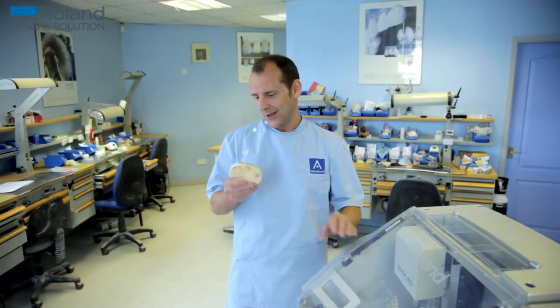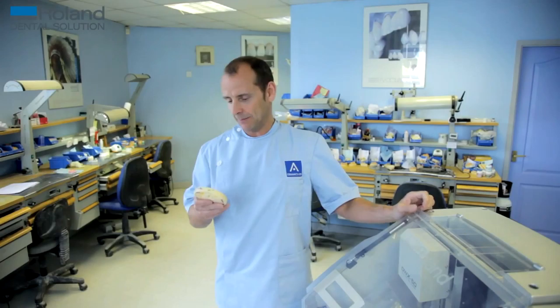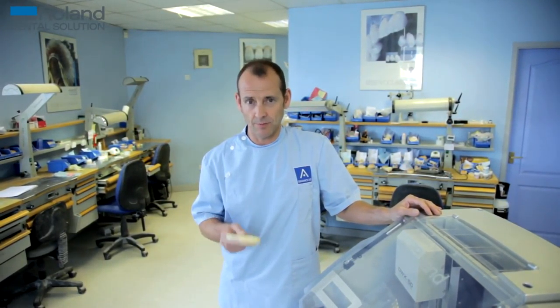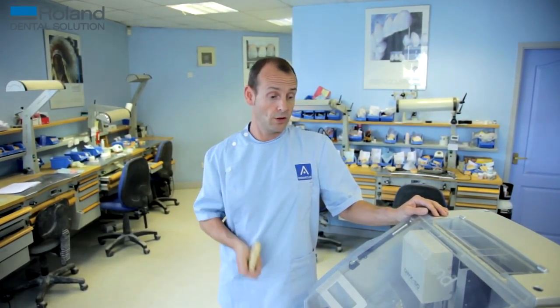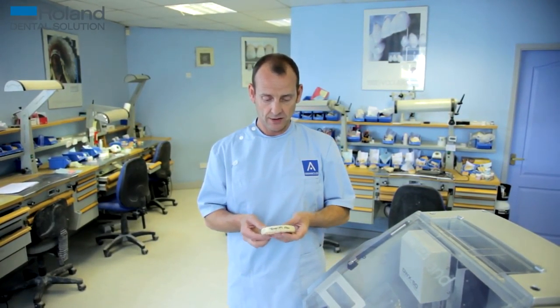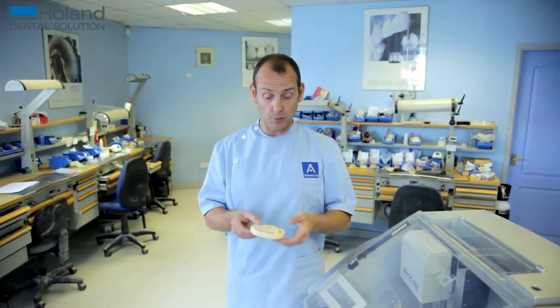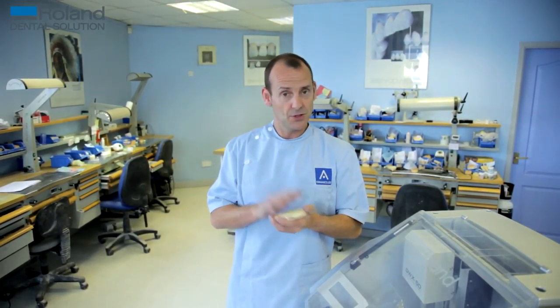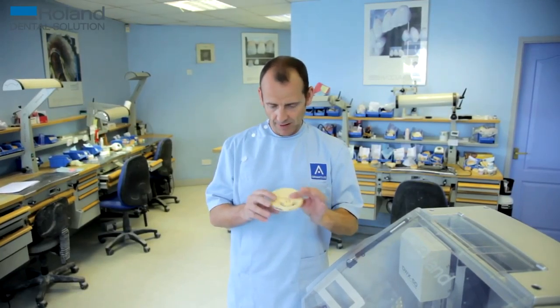Another great benefit of this machine — and as a technician this is one of my favourite benefits — is temporary bridges. I personally hate making temporary bridges. Temporary bridges used to be the bane of my life. Now they're one of my favourite things, because we can design a temporary bridge on the software, press a button, and the machine mills a temporary bridge that's virtually finished — we just have to cut it off and polish it. These discs come in all different shades, so it's simple to just design and polish. The machine can do them better than I can — I don't like to admit that, but it's the truth. It makes them to perfection. I love temporary bridges now.